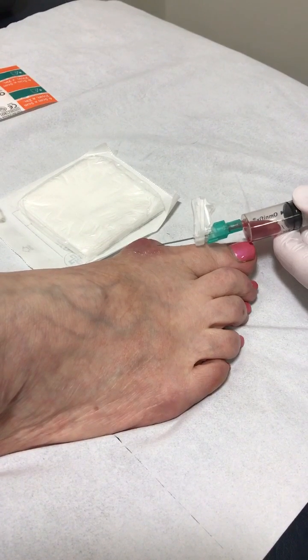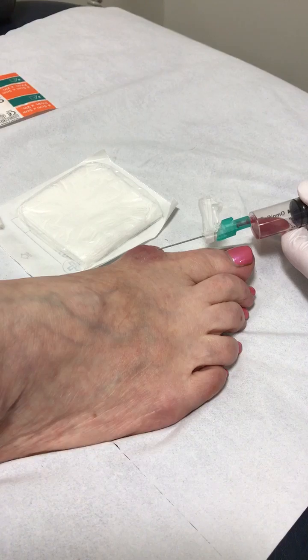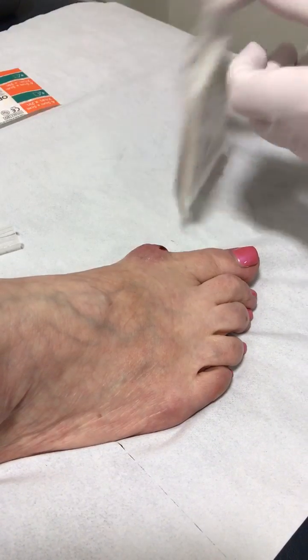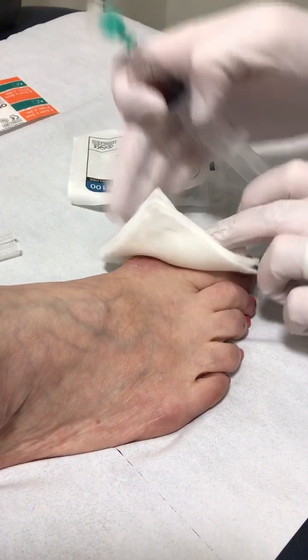You didn't think it was going to come, did you Jake? You can do it, it's all right. You'll hear a little pop — you ready? We obviously had our plaster ready before so that we don't get any claret anywhere.